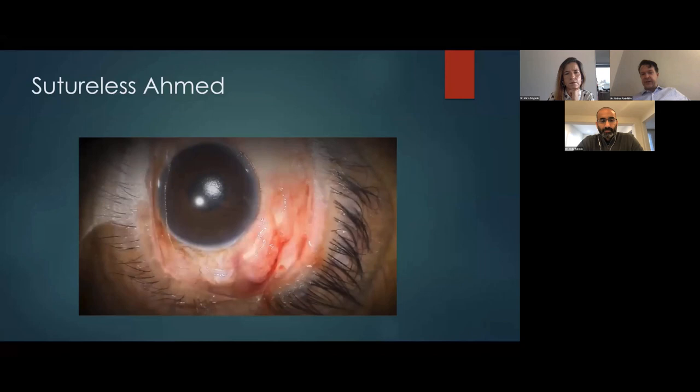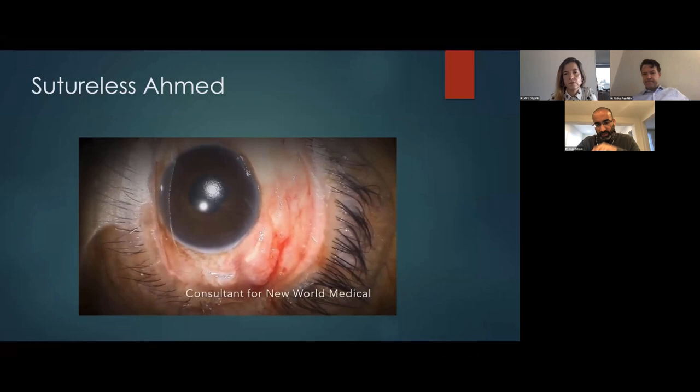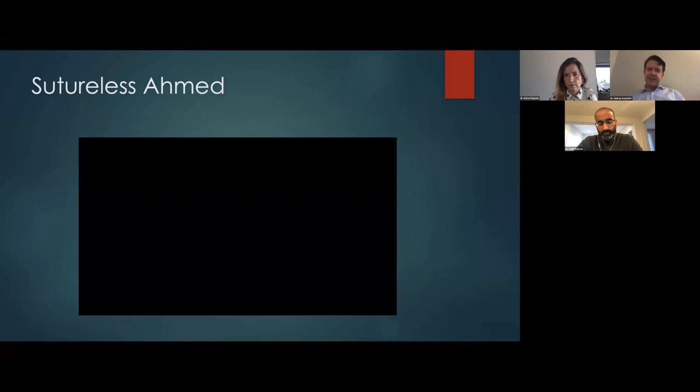So, how long do you actually squeeze the conge together to keep it in place post-gluing? Do you hold it there for a count of 5, 10? What do you do? Yeah, I'd say maybe 10 seconds, something like that. When we were doing these cases for the first time trying to use this, that was a big debate that we had. Should it be a 30-second count? Should it be a 20-second count? But I think 5, 10 seconds is more than enough.